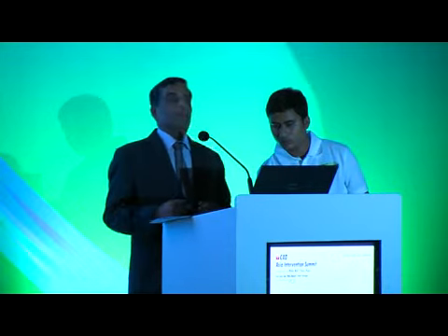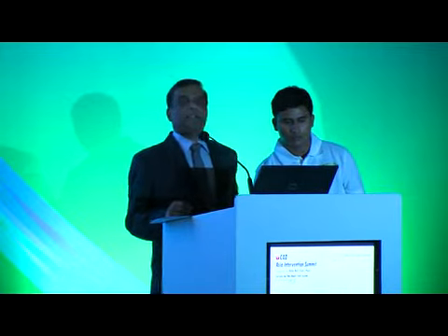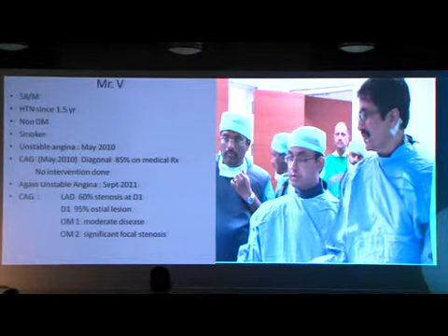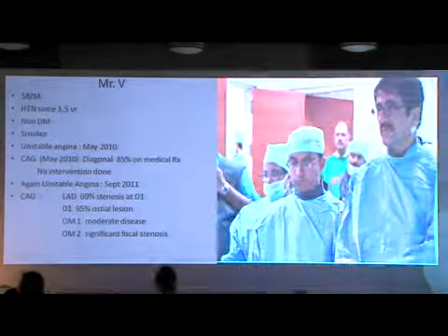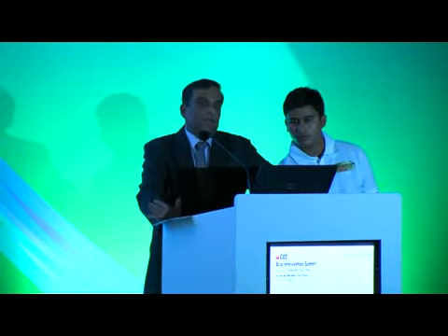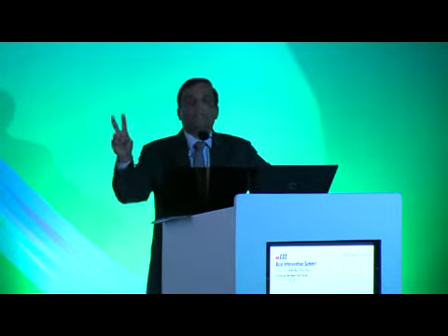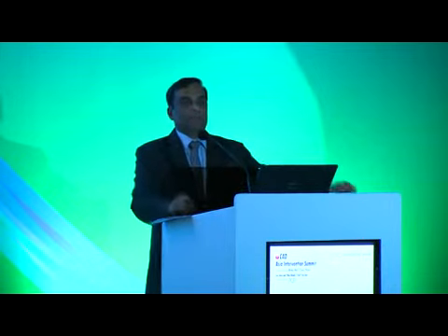So friends, what you are seeing here is not what you see in live case presentations in India every time. So what you see here is, for the first time in India, high definition transmission of a live case. On the right hand side is Dr. AMS Hiremat, on the high definition TV, and on the left hand side you will get the coronary angio from the screen. These two channels are different. In all the meetings we do in India, two channels are mixed in picture format.